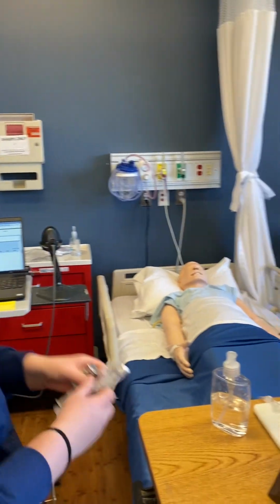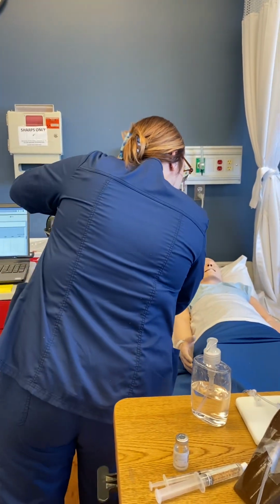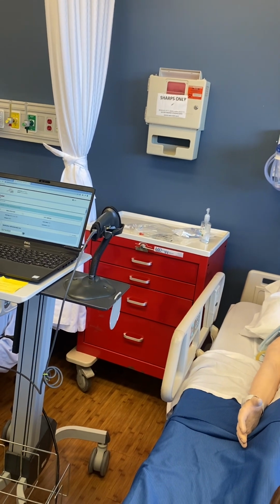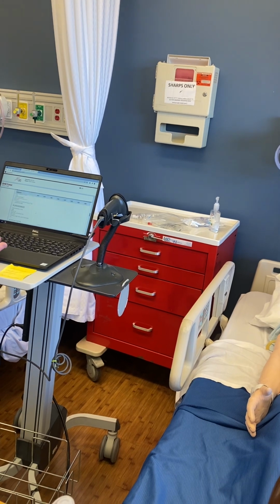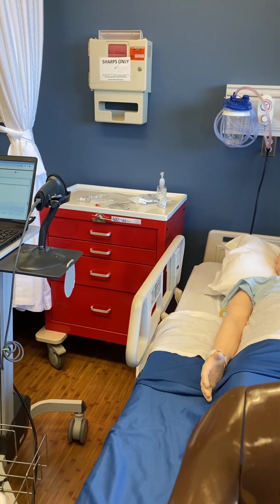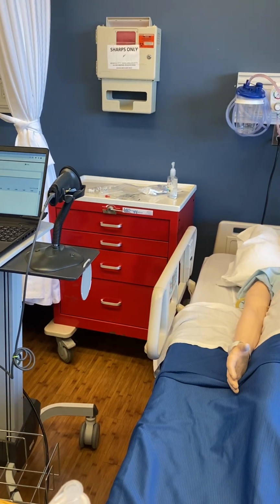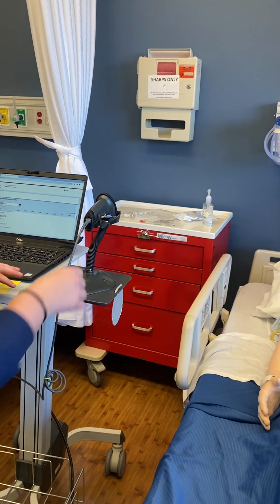Alrighty, hello Red, how are you? Can I just check your name and date of birth? 06/26/1935. Double check that with my MAR, 06/26/1935. Perfect. Red, do you have any allergies that I should be aware of? He'll say no. Just want to go back to the furosemide. Okay. And then he said he did not have any allergies.